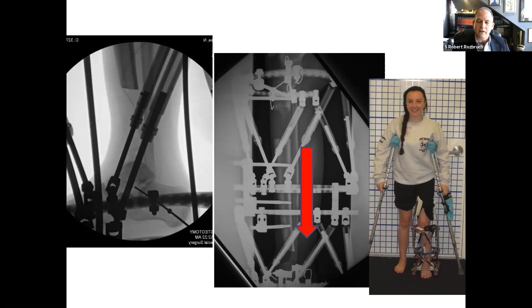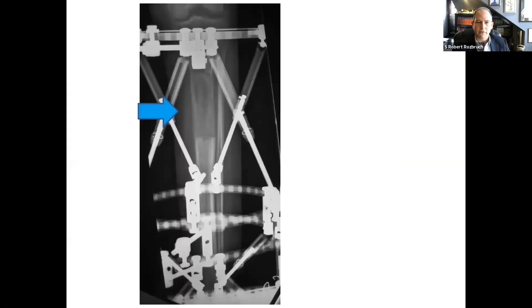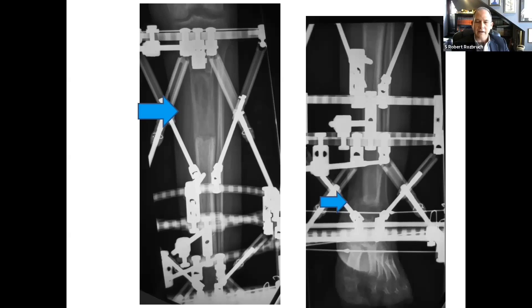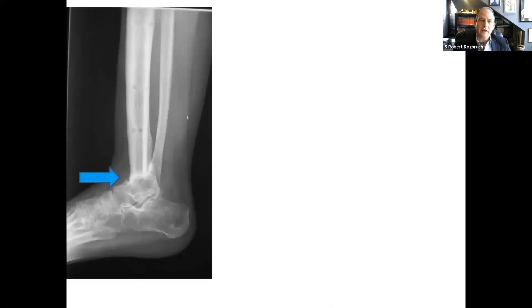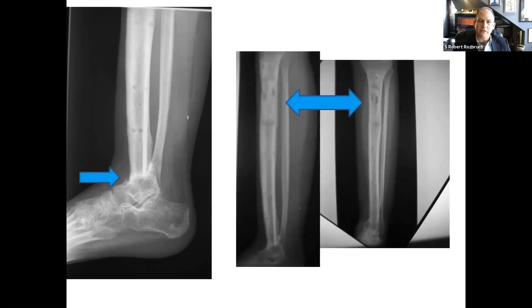This is a two-level Ilizarov hexapodal spatial frame illustrating a bifocal approach. At the end of the lengthening and into the consolidation phase, you can see consolidation of the tibia regenerate at the lengthening site and docking at the ankle site. After healing and frame removal, there is a solid arthrodesis that is stable and well-aligned at the ankle, and the proximal tibia regenerate — on both the AP and lateral views — is well-healed and well-aligned.